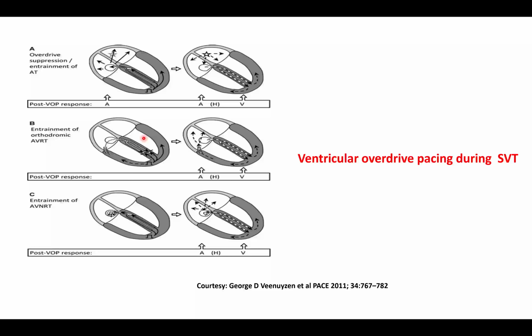I'll go to the next. If it's an AVRT, and we have already discussed pathway mediated tachycardia, that is AVRT, A and V are an essential part of the circuit. If I start pacing the ventricle during tachycardia and stop, your last beat will be V, A, V tachycardia.